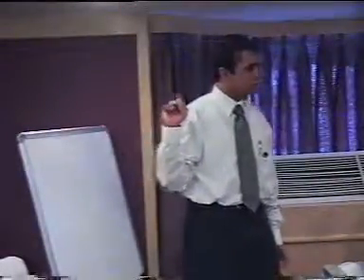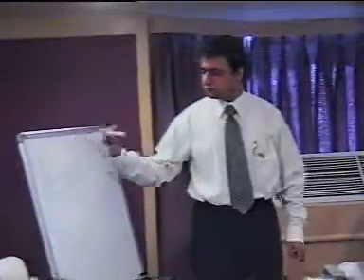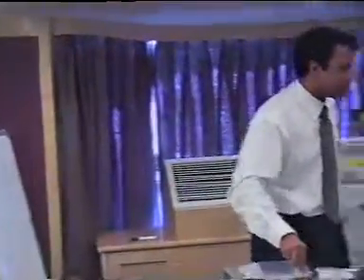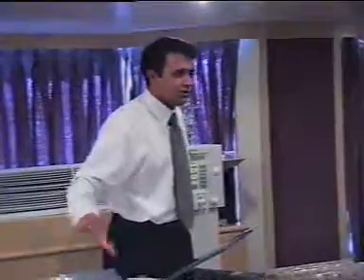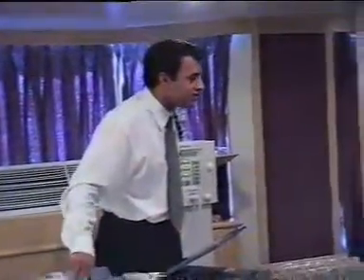Only oxygen should we use? Air. Why do we use that? Okay, so let's say compressed air. Why do we use air? Any ideas? Any suggestion? 100% oxygen. Yeah. But why don't you want? Why? Your problem is hypoxia. You would try and give 100% oxygen. Why don't you want to give 100% oxygen? Because of oxygen-induced damage. Yeah, this is one important thing.